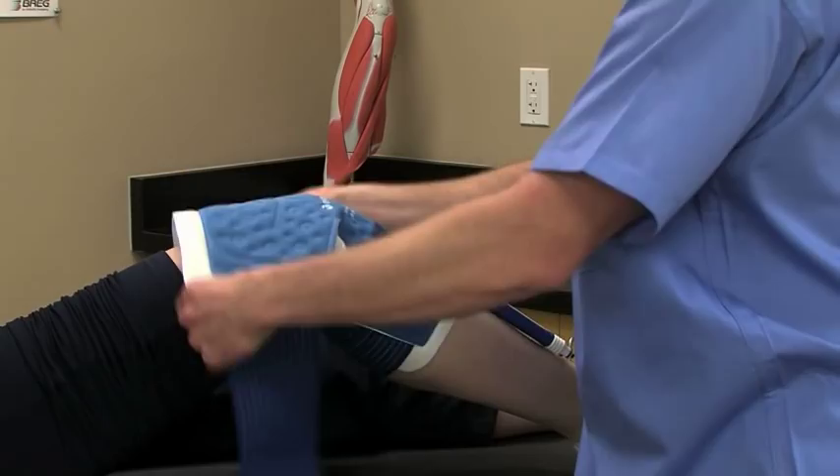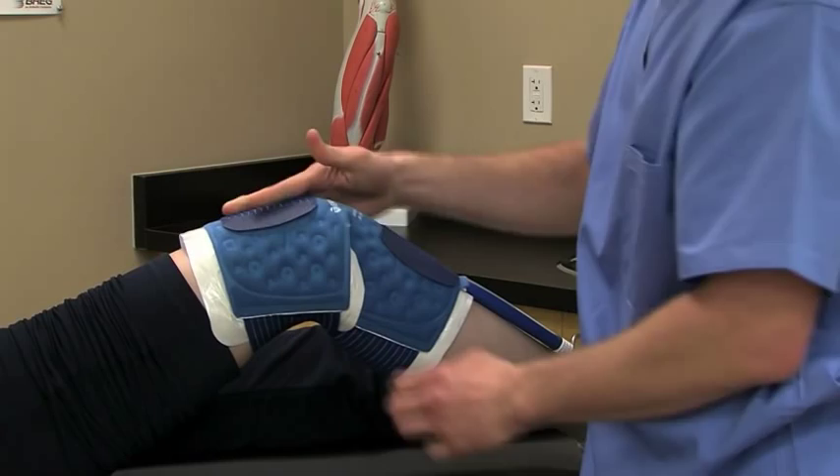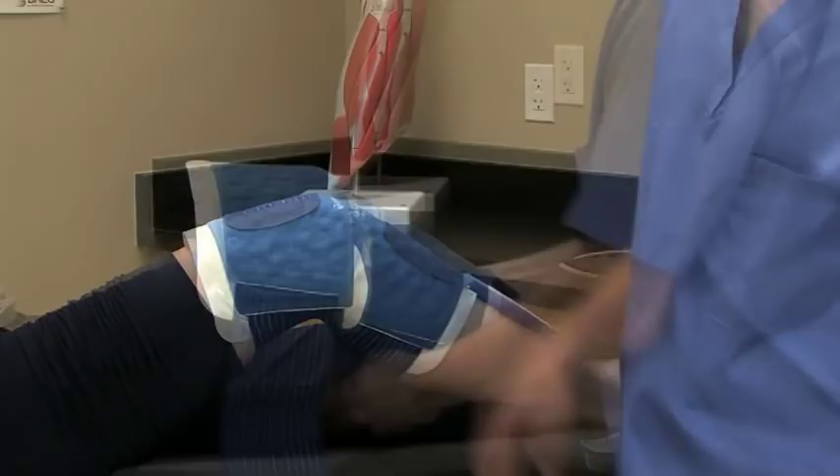Usually, the universal pad is applied with the hose pointed in the proximal direction, but you may apply it with the hose pointed in the distal direction if it's more comfortable for the patient.